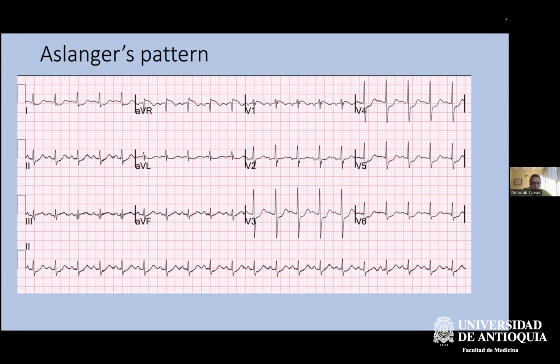You need either a positive troponin, but the troponins won't help you for many hours. You can't tell if it's a non-OMI or an OMI, even if they are elevated. You have to have the EKG to tell the difference between persistent symptoms from gastroesophageal reflux and persistent symptoms from ACS. So that's why it's really essential to use the EKG and to have artificial intelligence to help you do it.